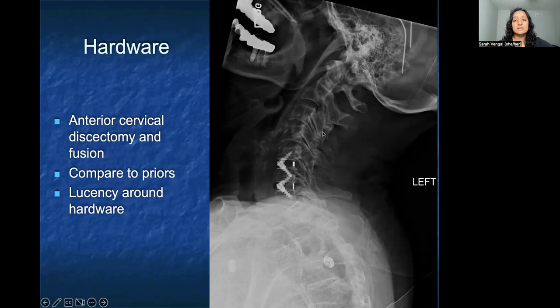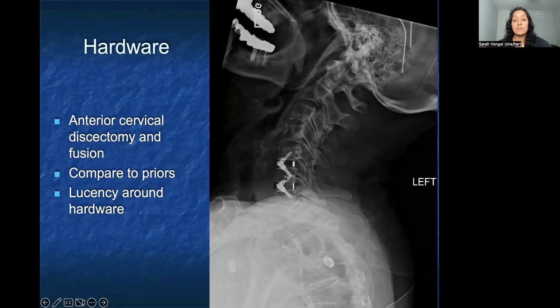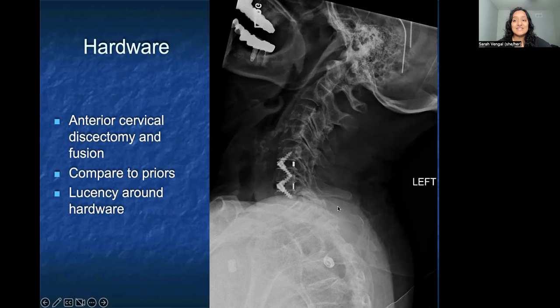Finally, hardware is more radio-opaque than most bones. Even with this film not having particularly good x-ray penetration, you can still see the hardware adjoining the cervical bodies from anteriorly — this is typical of what you might see for an anterior cervical discectomy and fusion. The most important thing when you see hardware is to compare it to prior imaging to assess whether positioning has changed. When looking for problems with hardware, you're looking for lucency or darker coloration around it, indicating the hardware is starting to shift or back out of position.